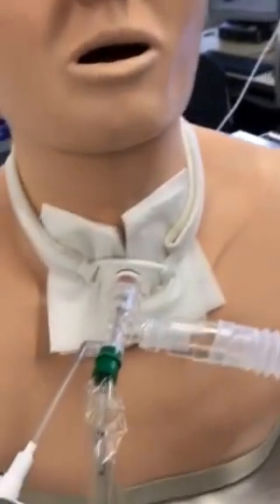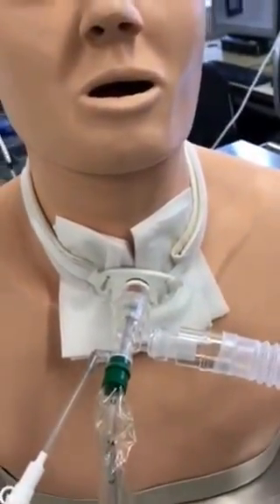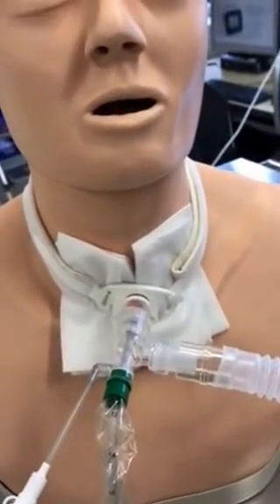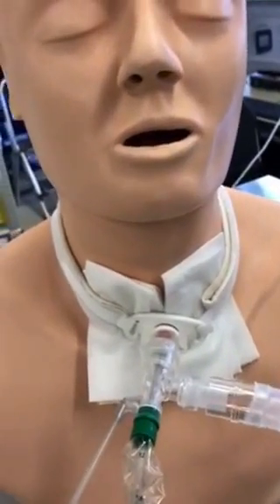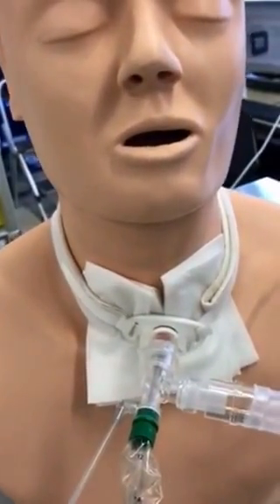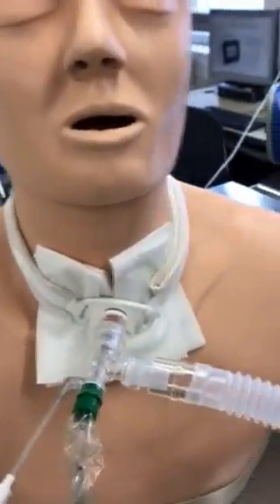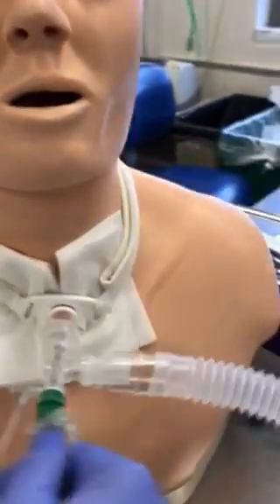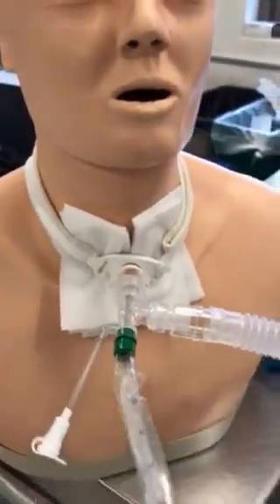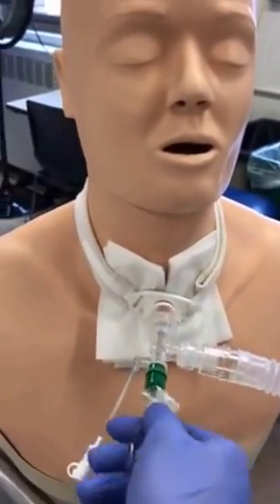With this as well, the cough machine is made up of inhalation time, which uses positive pressure, and exhalation time. When you switch to exhale, you're using negative pressure to draw up the secretions. Between each sequence for rest, you should have at least 20 to 30 seconds and give them that breath in between. Then use that time if you need to go down the ET tube or the tracheostomy tube. If you need to advance your suction down to get the remaining secretions, you can always go down.